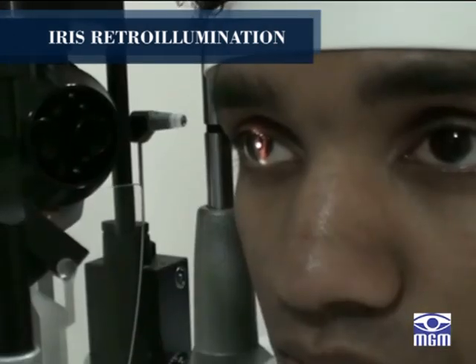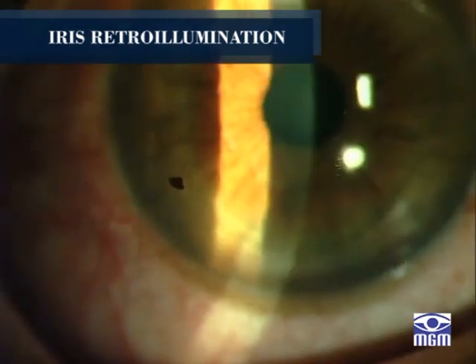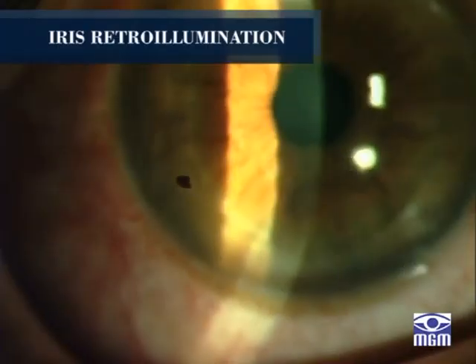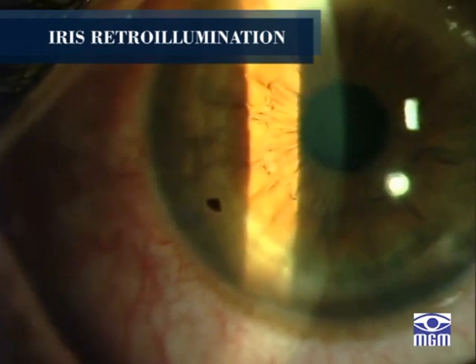In iris retroillumination, the microscope is directed straight ahead. The light beam is directed to the iris at an angle of 45 degrees. This technique is most important for the thorough examination of the cornea.